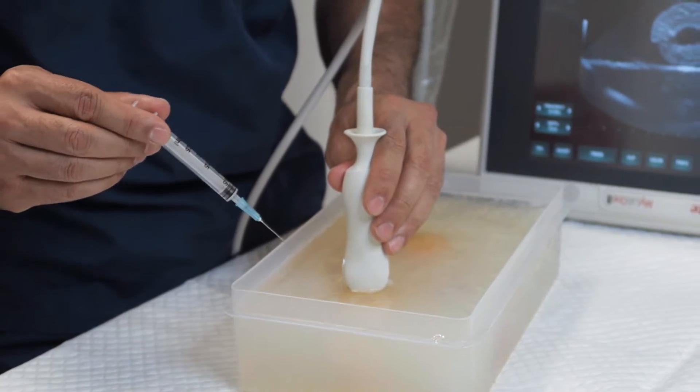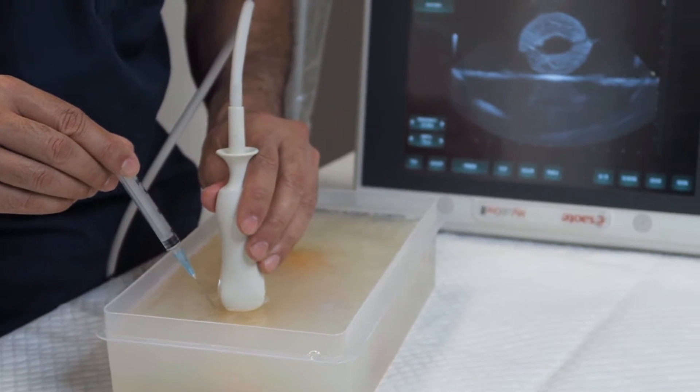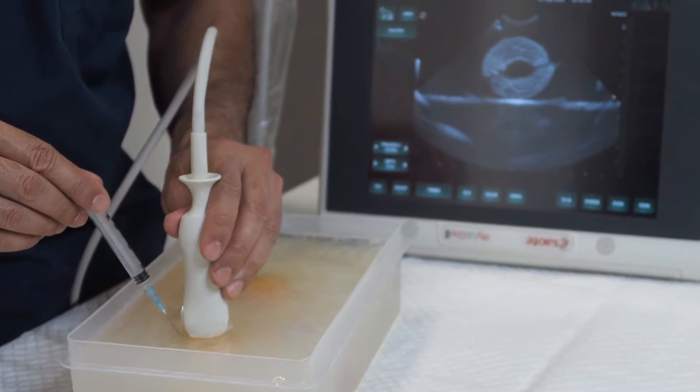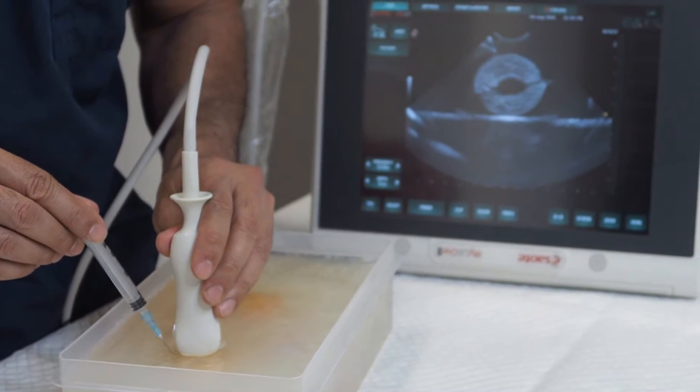We find the area of interest. We insert the needle just in front of the ultrasound, angling towards the middle of the probe.